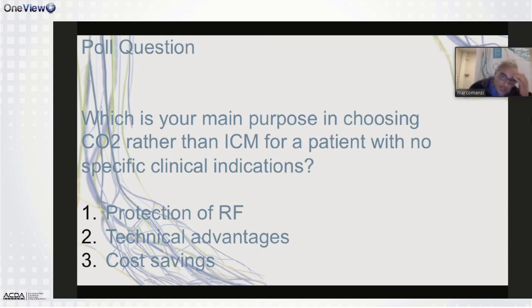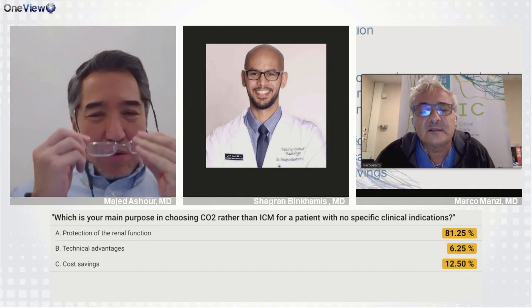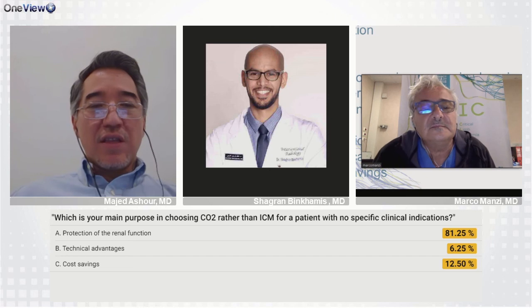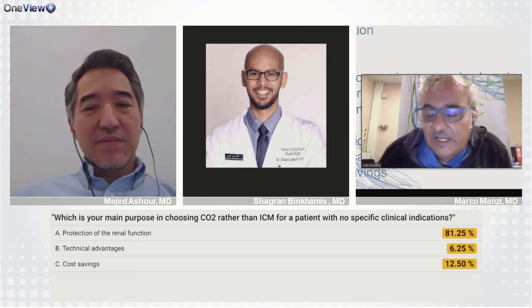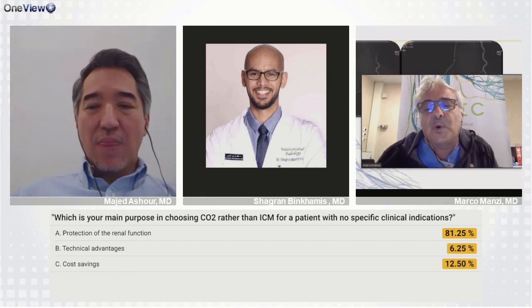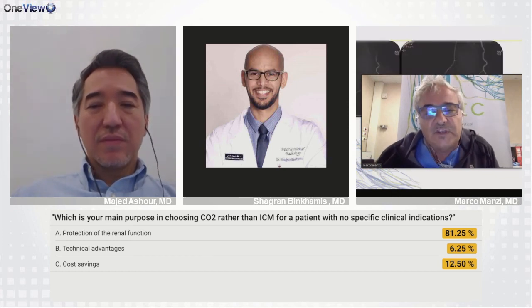Now maybe we are ready to see the answer. Yeah, okay. Wow, this is interesting. So 80% said they're going to use it to protect the renal function. This is a very good message because everybody is realizing the importance of using CO2 to protect kidney function.